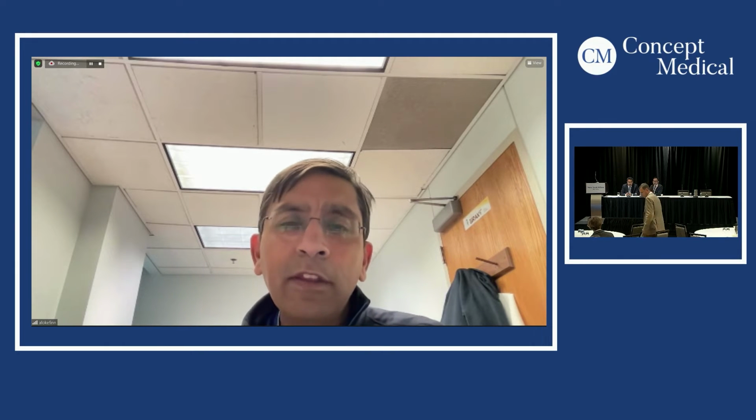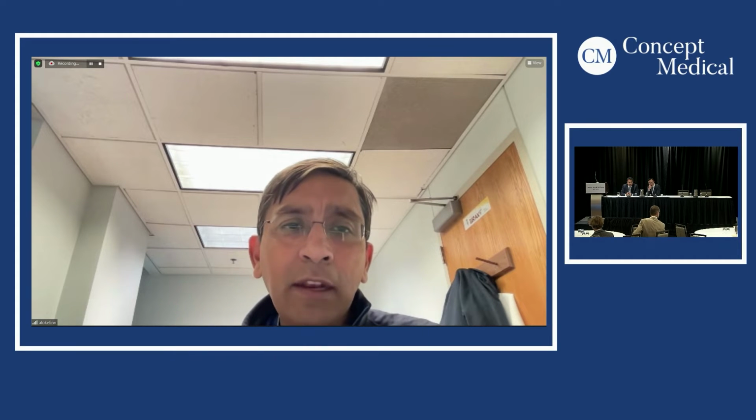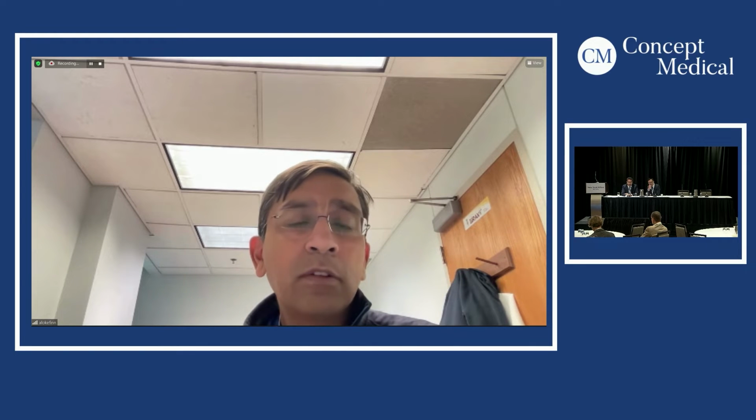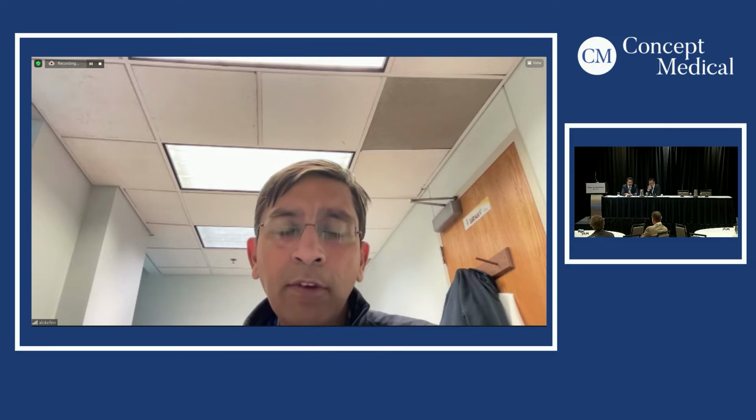Eddie can talk. The PK studies, Sahil, are really meant to support its efficacy, but as I tell many people, we can never tell efficacy until we get into the clinic and we have clinical data from clinicians like yourself who tell us their clinical experiences, or it's in a randomized trial. Eddie can speak better than I can to the clinical efficacy of this balloon. What I can speak to is the fact that this balloon seems to be fairly safe, does not have issues with toxicity or emboli, that I think are significant factors in the use of paclitaxel-coated balloons, especially below the knee. So I think this is where the preclinical ends and the clinical experience can take over.